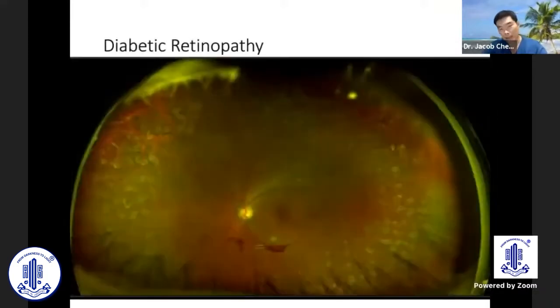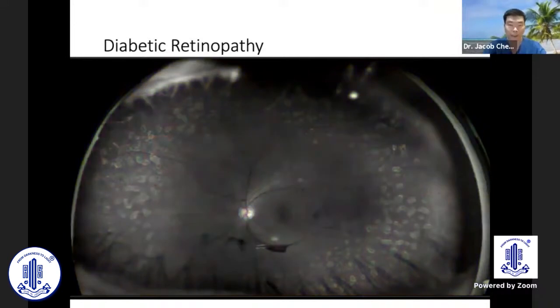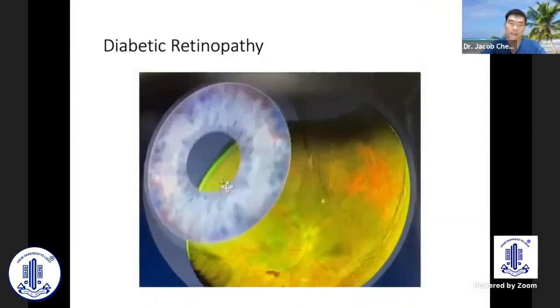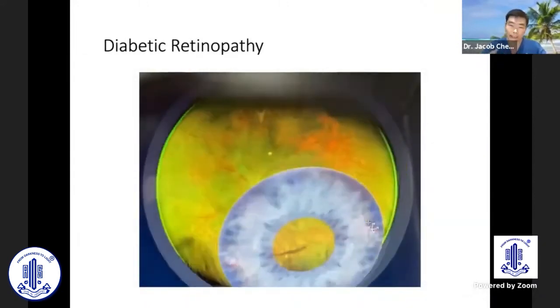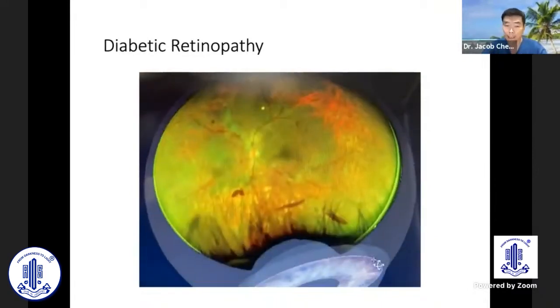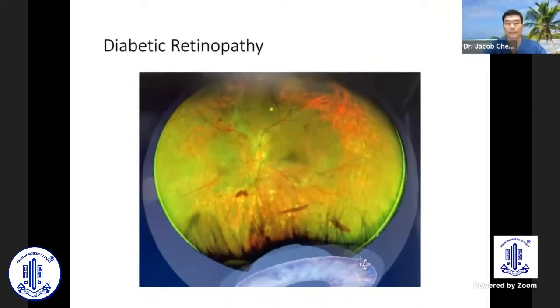This is another patient, again with pan-retinal photocoagulation done, probably proliferative in nature, evidenced by the pre-retinal and vitreous remnant hemorrhage. The green channels, green laser, will highlight the retinal pathology well, but sometimes applying the 3D function on my California, you can actually see the areas that are deficient or have been adequately or inadequately lasered, in a sense, with a 3-dimension picture.